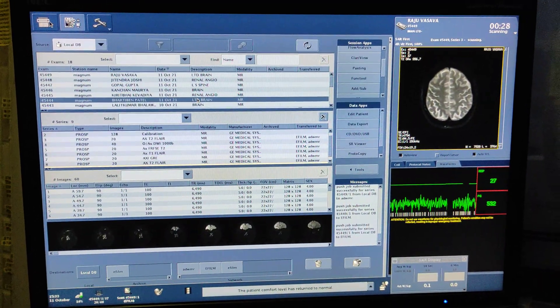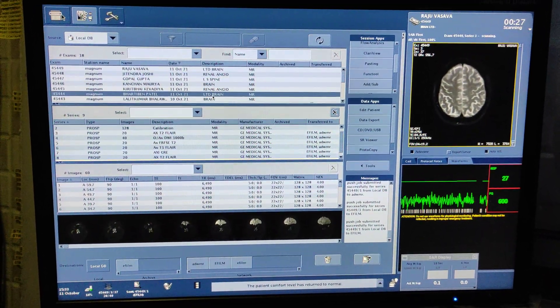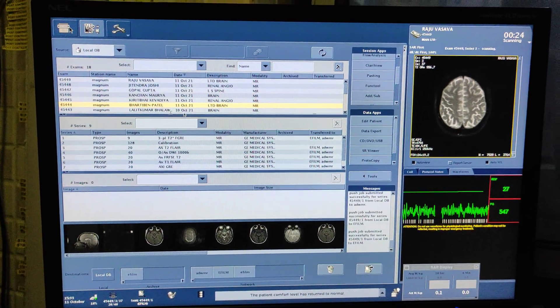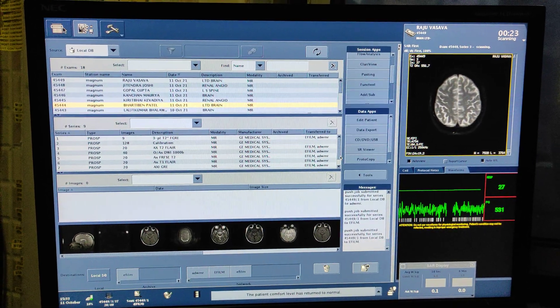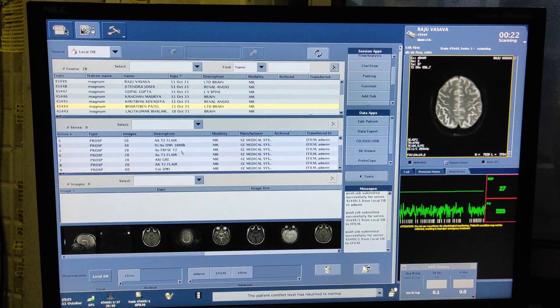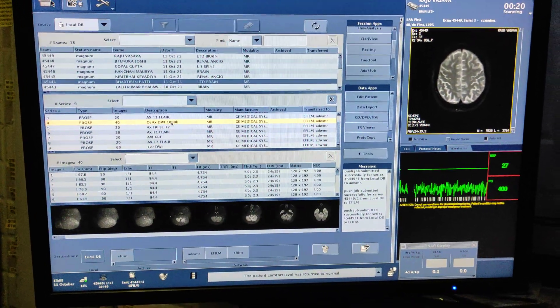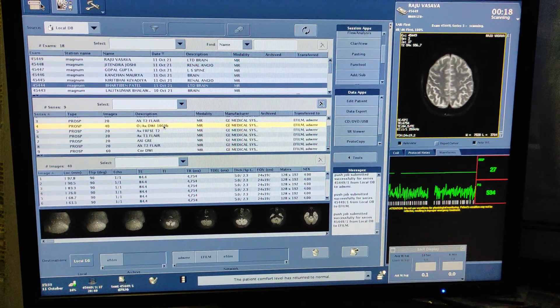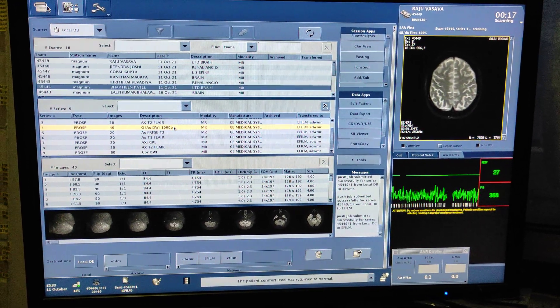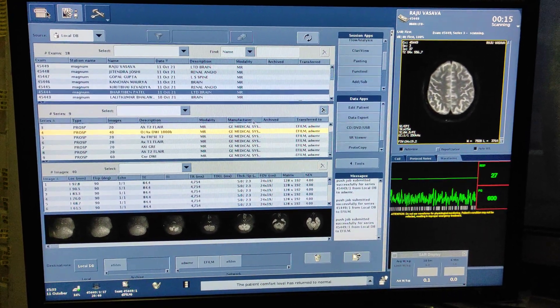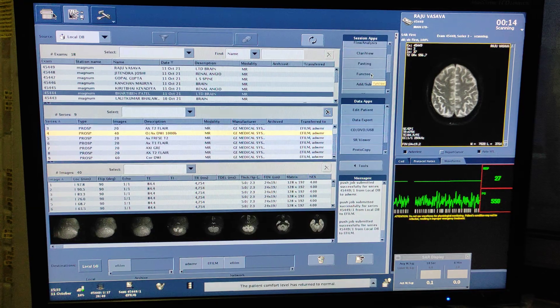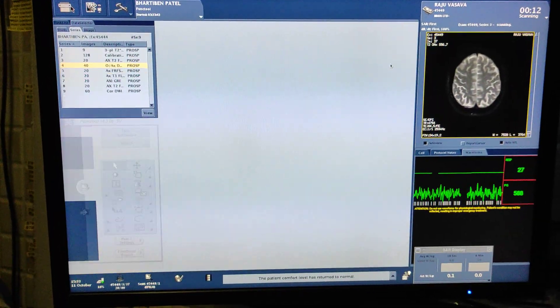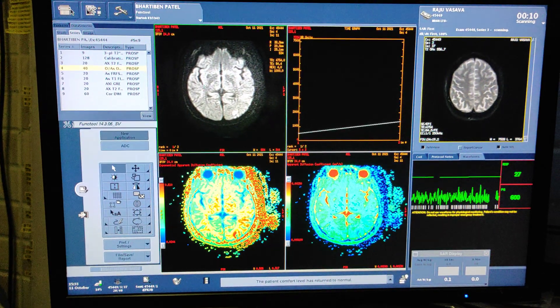First of all, we have to go to the patient data, simply select the patient name. Then after, you have to select a diffusion weighted sequence. Then after selecting the series, you have to click on Func Tool.